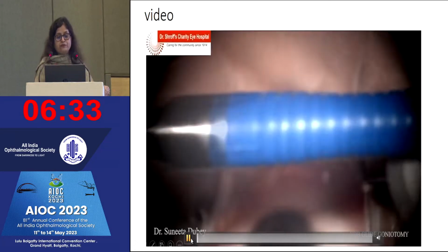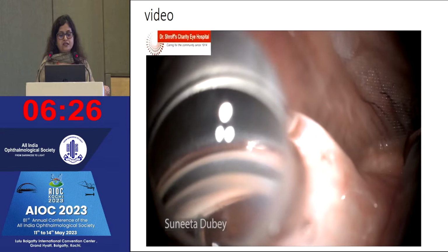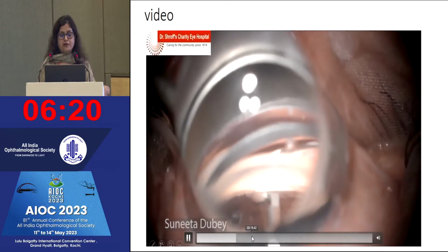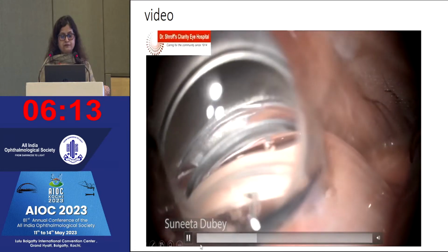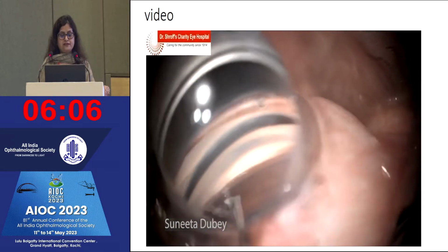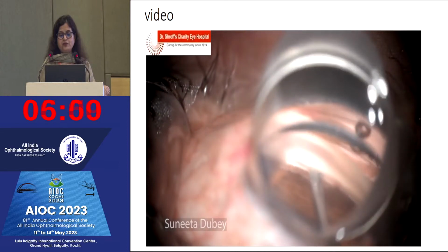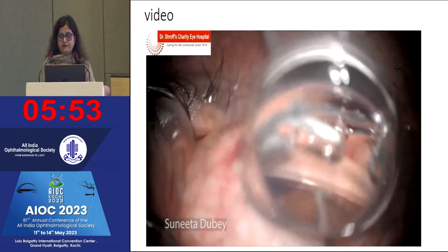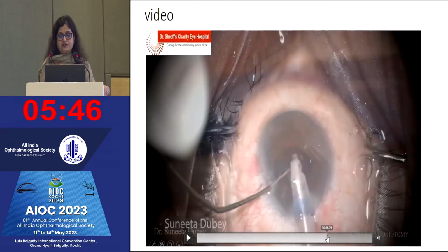So this is the procedure, this is the blade, and you introduce it, engage the trabecular meshwork, and start excising it in one direction, and you can see this TM nicely coming off. So you can just keep rotating your gonio lens, and you can just get this strip removed. You just turn it 180 degrees in the opposite direction and do it on the other side. So you then remove these strips on either side. So this will help prevent re-occlusion, and then you perform the phaco surgery after removal of this.